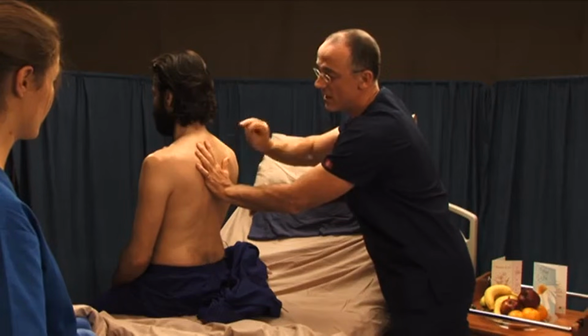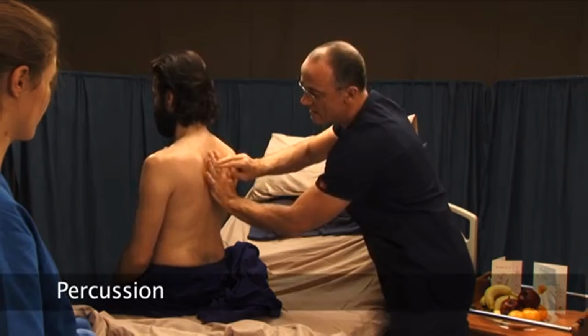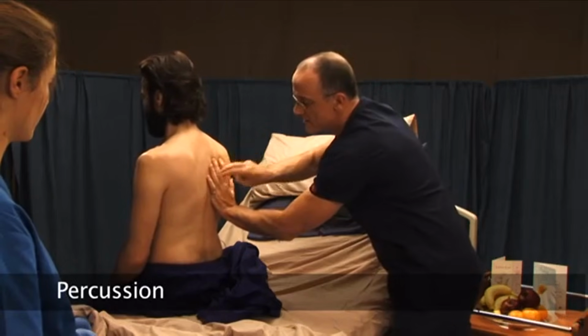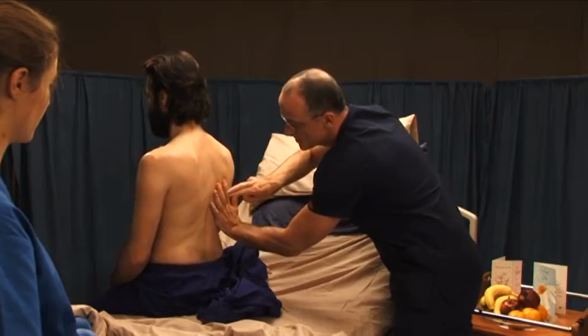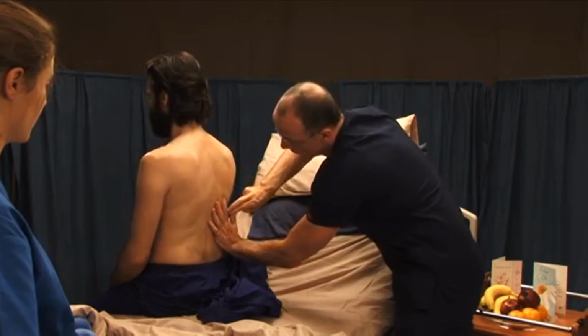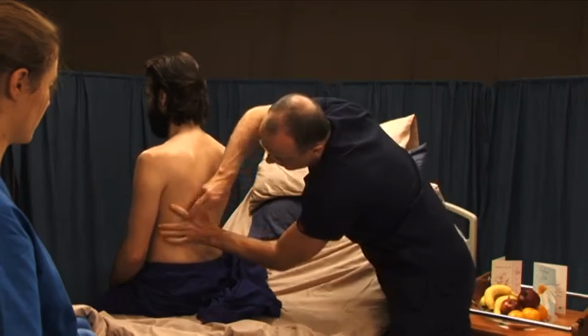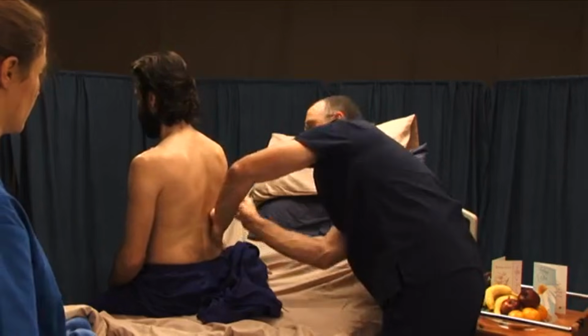I find it easy just to use 2 fingers in between that, and just going down systematically through the chest, moving around and just comparing the noises.